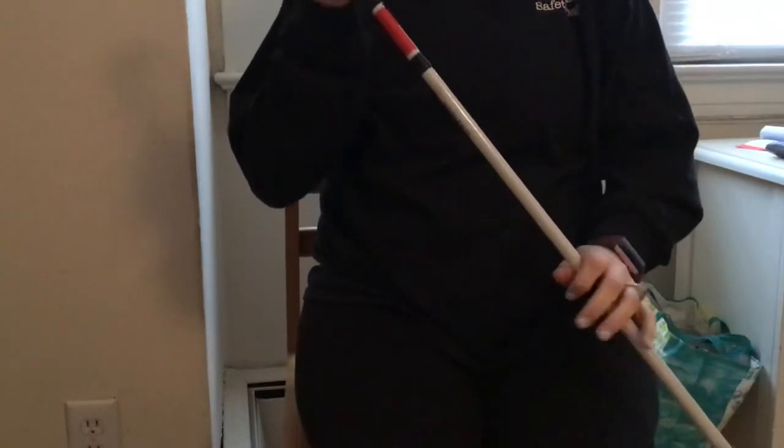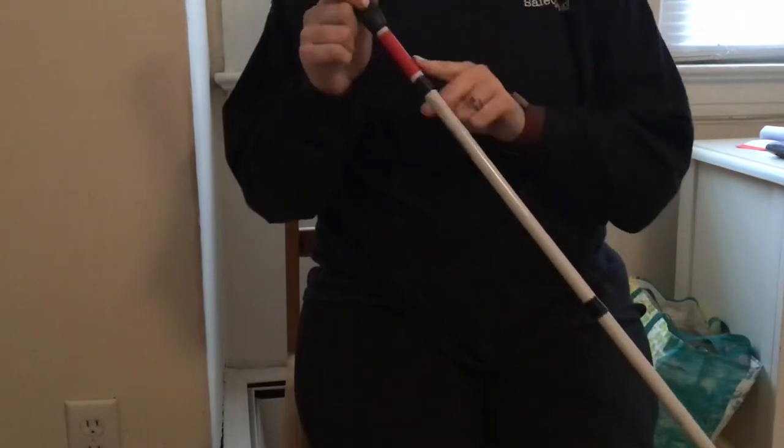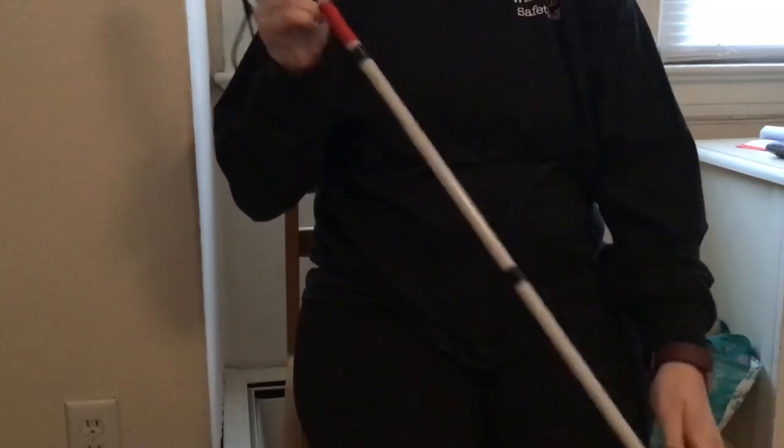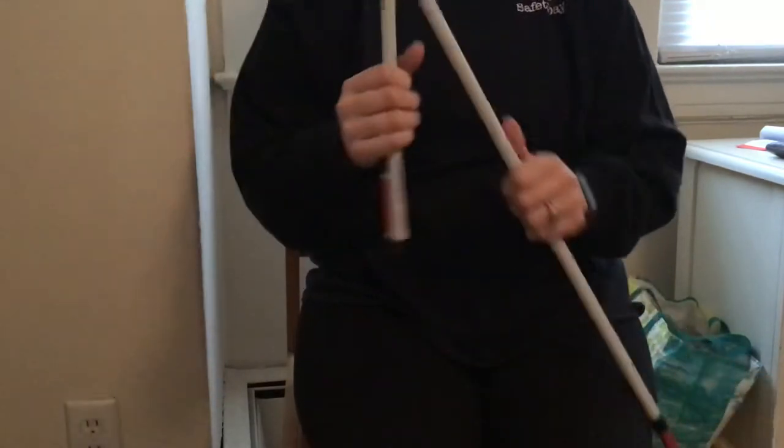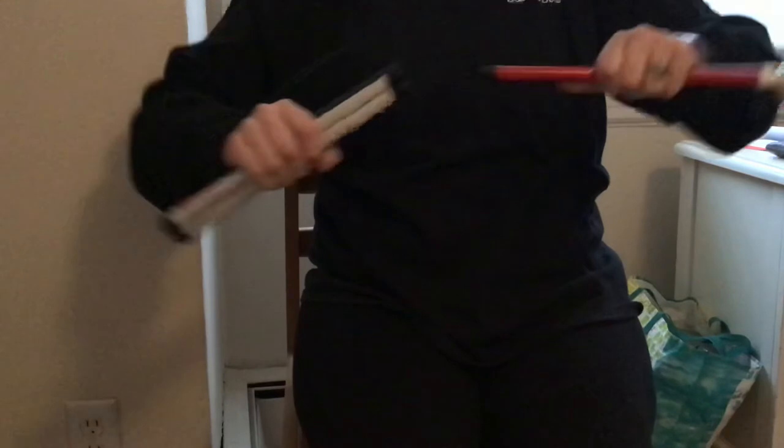I'm just going to give a quick demonstration on how to fold and unfold your cane. Each cane has sections, unless it's a rigid cane, which means it doesn't fold up. You simply just pull it apart, close it together, and do that for the whole cane.